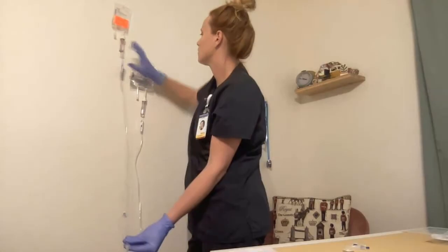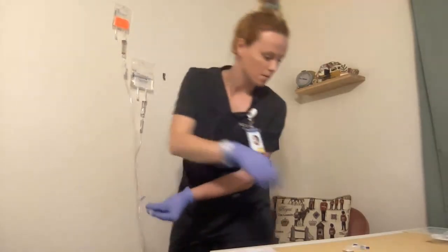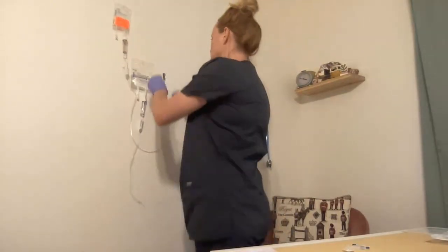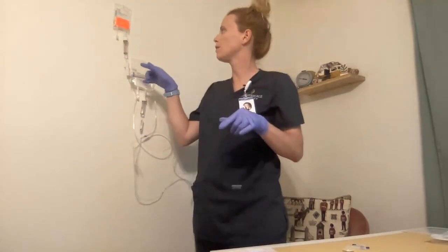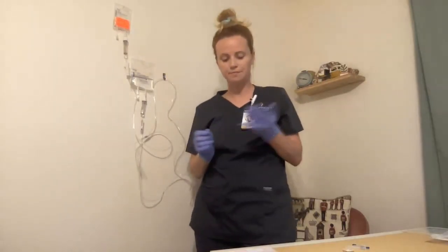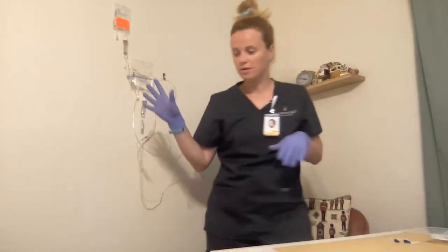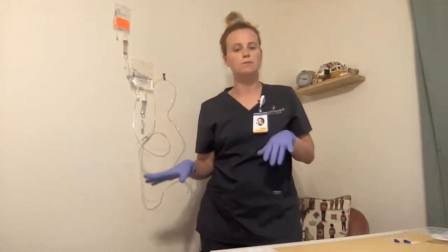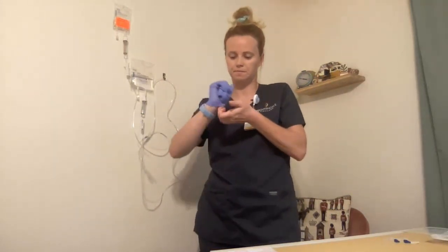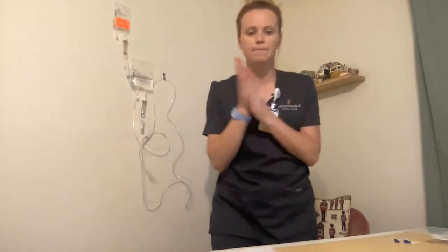I have counted for a whole minute. I'm going to clamp both lines and put my cap back on. My patient is hooked up and running at both appropriate rates — 38 and 100 drops per minute — per the physician's orders. I'm going to clean up any trash, assess the patient's IV site to make sure it's appropriate, make sure the patient is comfortable, remove my gloves, and perform hand hygiene. And that's it.